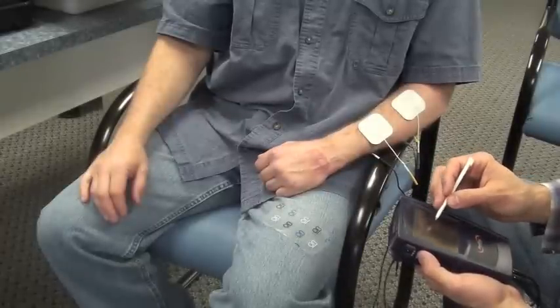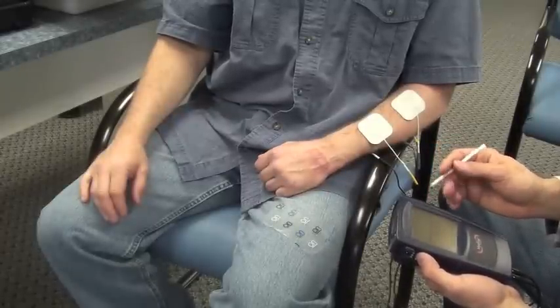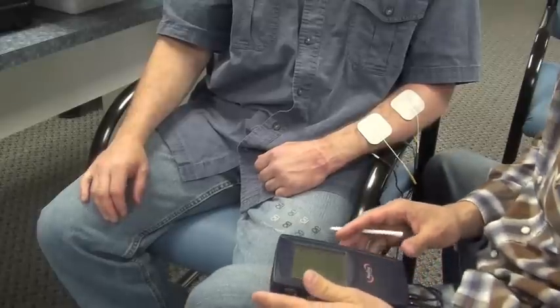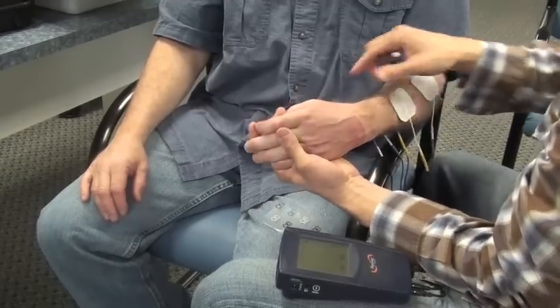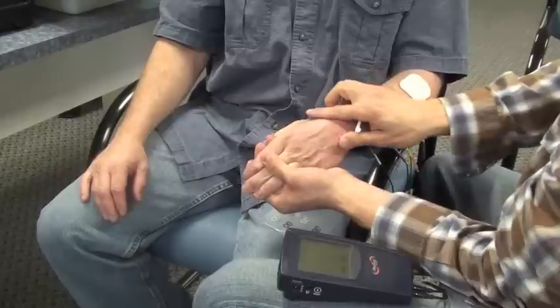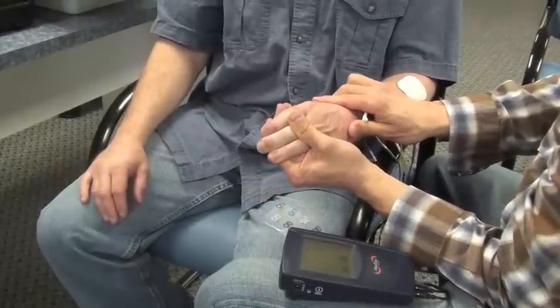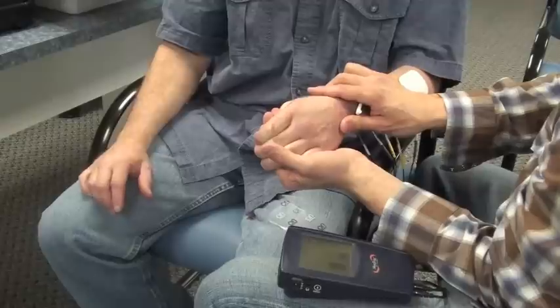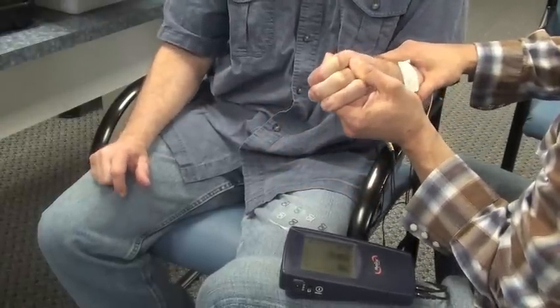After you apply the EMG electrodes to the flexors, it's time to confirm the placement. You'll turn on the unit and go to the EMG assessment mode. You can choose line graph or bar graph display. Passively stretch the wrist and finger flexors and have the patient squeeze or activate the finger flexors. By looking at the display, you can see if the signal is strong, and that will tell you if the EMG electrode placement is suitable.